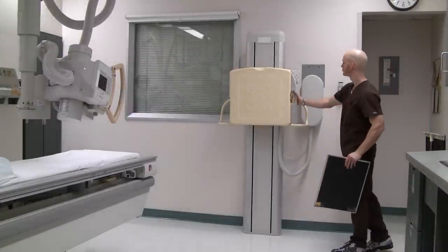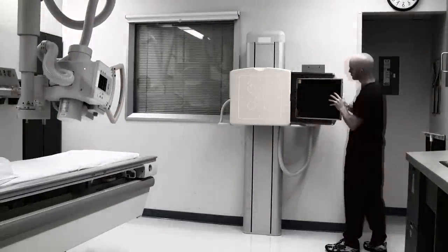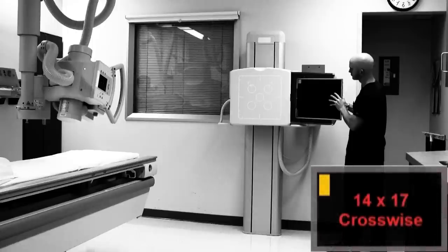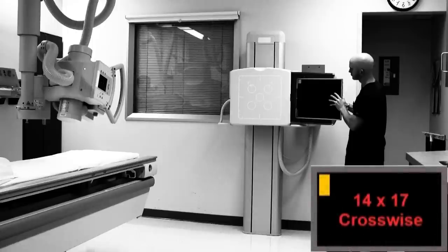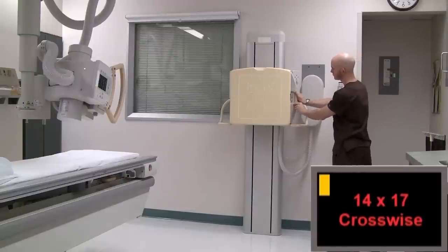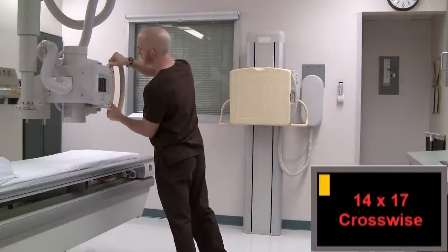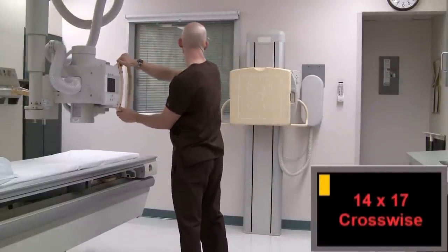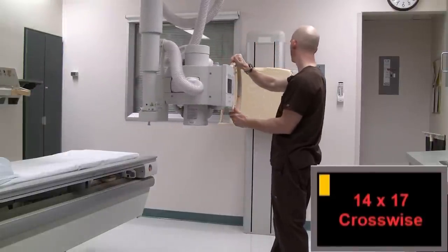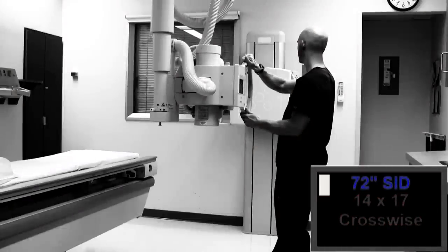Begin by placing a 14 inch by 17 inch cassette crosswise and upright in the wall bucky. Make sure the blocker is at the top of the cassette. Move the x-ray tube and center the central ray to the cassette. Position the x-ray tube with an SID of 72 inches.